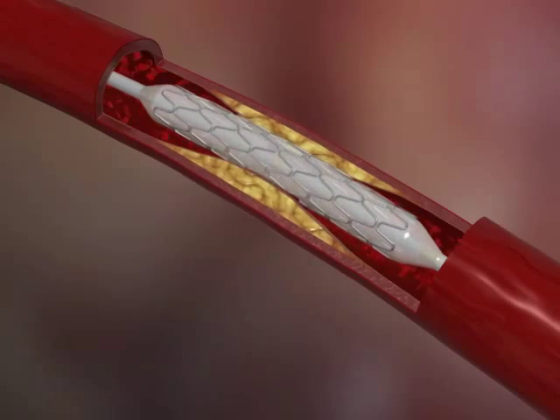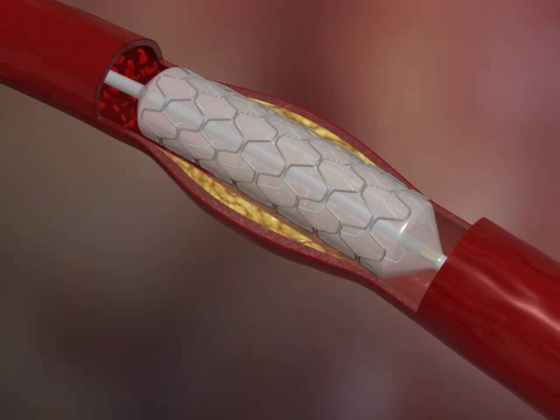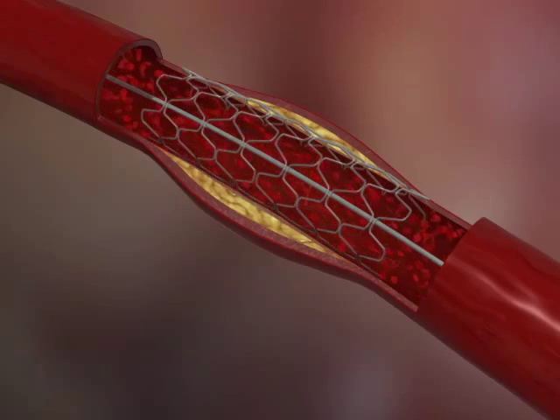It also makes it possible to determine the need for thrombus aspiration prior to implanting the stent. The total duration of the procedure is very short. In the absence of a thrombectomy, it takes no longer than 5 minutes.